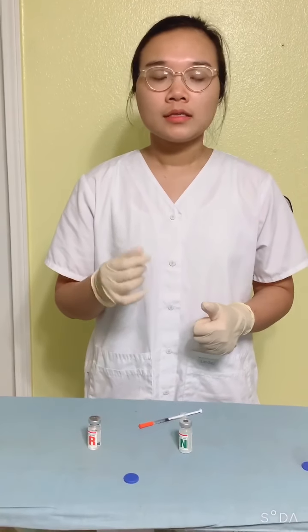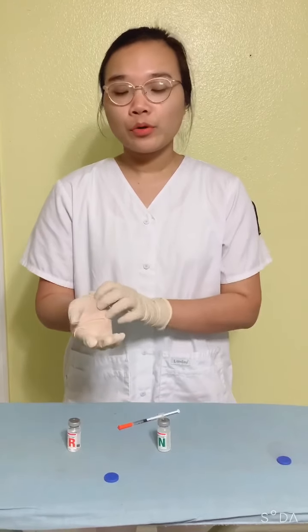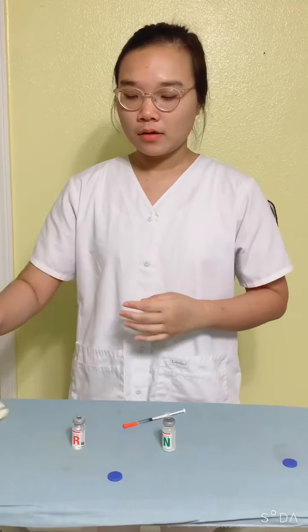And now I would inject the needle into the patient's skin, slowly administer the medication, and then I would withdraw the needle. Do not cap. Gently apply an alcohol pad to the site and safely dispose the needle in the biohazard bin. Then I will remove the gloves, perform hand hygiene, and document.